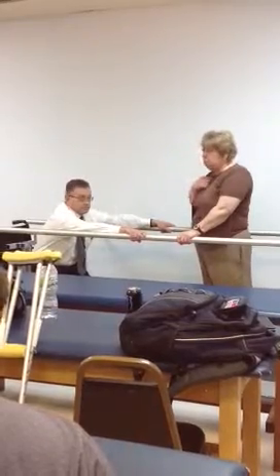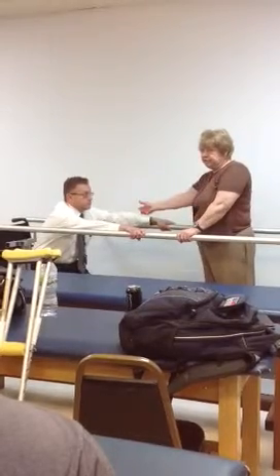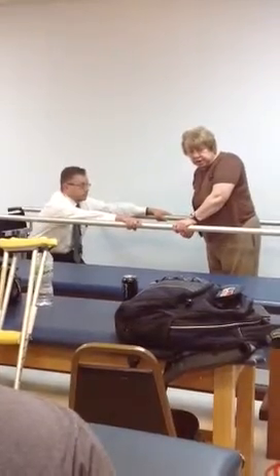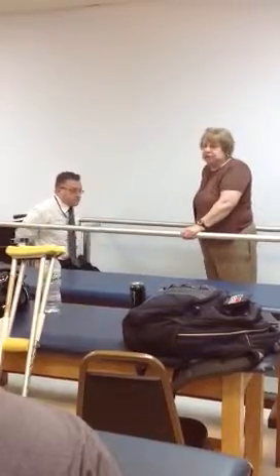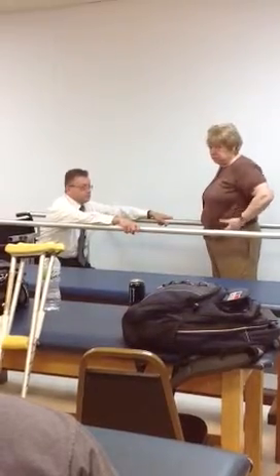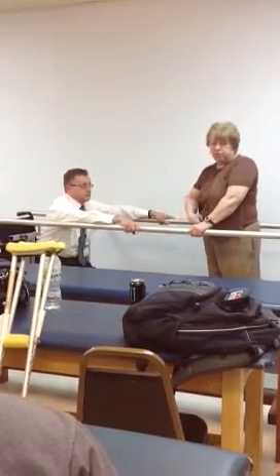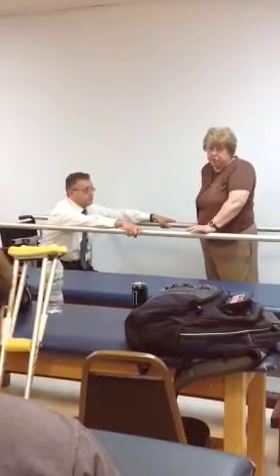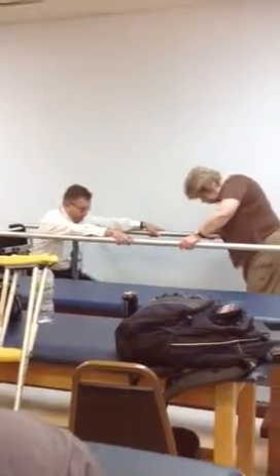So, what I have to do is I have to be there to make sure that he pulls himself all the way up, because if he only pulls halfway up, he's gonna be in this position, okay, like that. That's not gonna work. So, if he has a pelvic band and it's closed, okay, what I can do is take a hold of the pelvic band in the front. If he happens to not have a pelvic band on his braces, then I have to take a hold from behind.